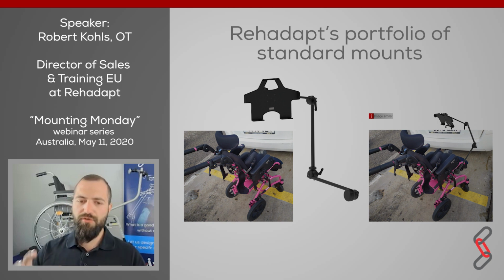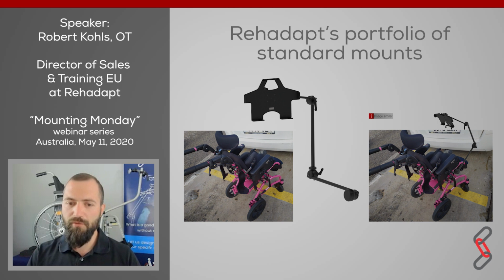So we have decided to choose a semi-open frame clamp in combination with an L3D, a very, very light mounting solution for this customer chair, and have attached the round frame clamp directly under the seating plate. For all of you that see the left picture, under the seating plate there is also a round tube where we could attach a semi-open, or better, a half-open frame clamp to attach the entire mount for the customer.